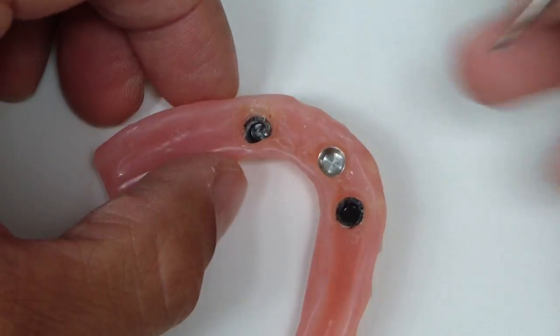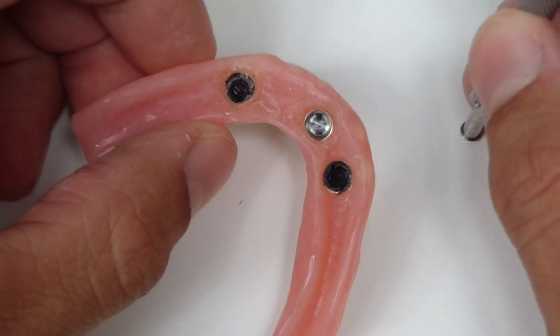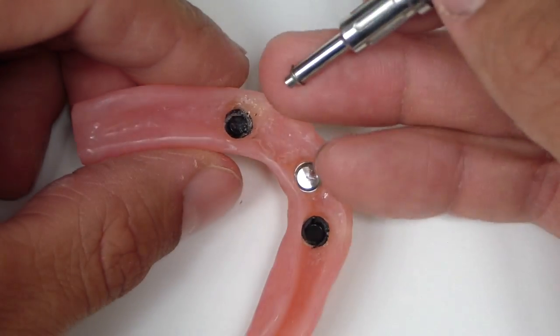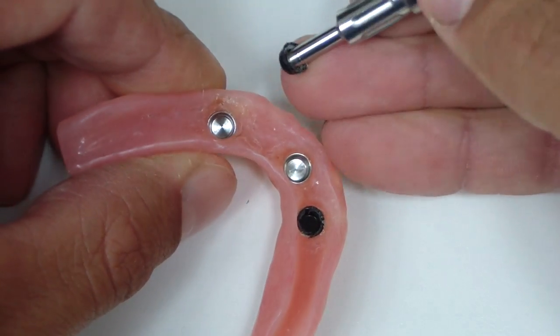The Teflon really works — I've tried wax before but it was really difficult. So we use this little tube, and there's actually a little hook to remove these inserts. We'll just pull that out of there.